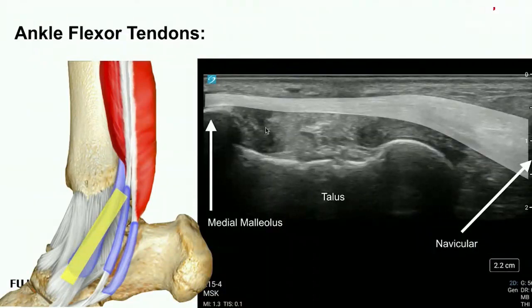All right, so distal to the malleolus, now we're traversing towards the insertion. The neck of the talus is a great landmark to follow this, but here's your tibialis posterior tendon, and the shadow of the navicular is out here. But the dynamic maneuver is the way to go. If all this looks ambiguous on the patient that you're scanning, not our patient today, it'll be very easy to see. But on the patient you're scanning, if all these tissues are blending together because they have a very degenerative ankle and the tissues just don't look right, then we're using ultrasound.